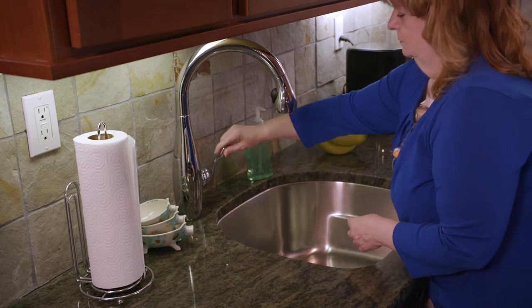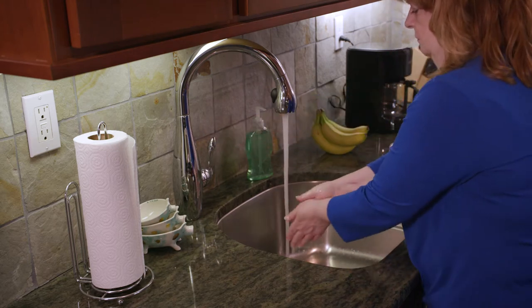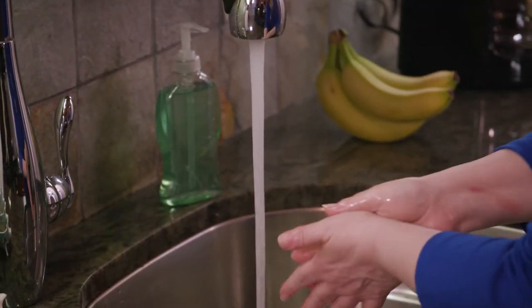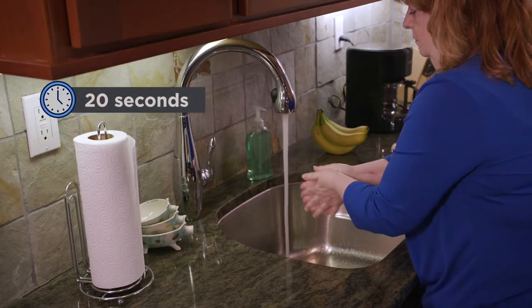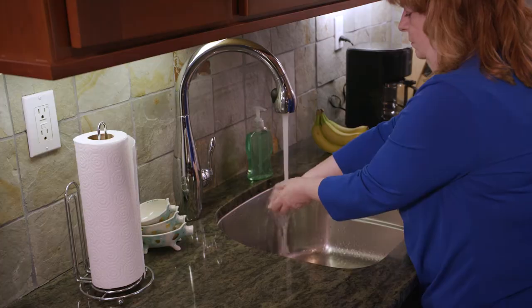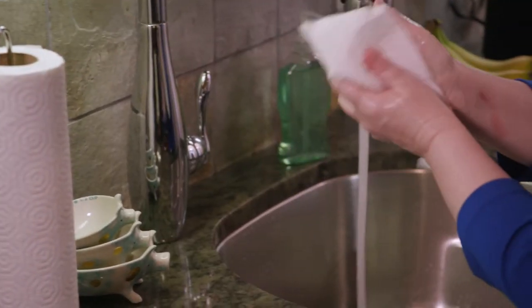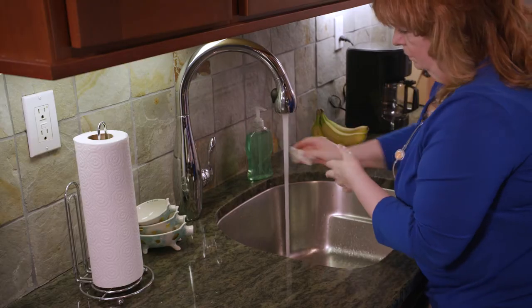When you're ready to start, clean your hands. If you're using soap and water, wet your hands and apply soap. Rub them together well for at least 20 seconds, then rinse. Dry them with a paper towel and use that same towel to turn off the faucet.